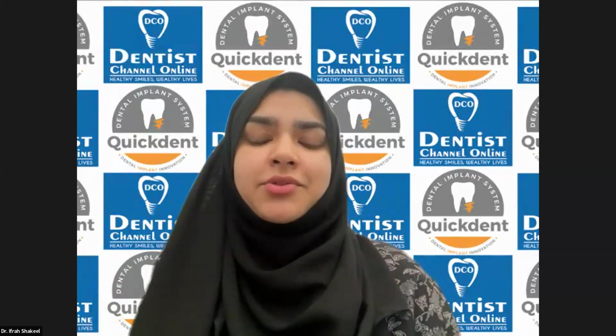All right. The next question is, which implant is universal for tooth replacement? I just told you that there is nothing like a universal key. The problem is that everyone wants to open all the locks with a single key. Corticobasal implantologists place basal implants all over, whether you have good bone or bad bone, single or segmental, everything. And conventional implantology places conventional implants all over. Actually, we have to see the patient, the situation, what the patient needs, and what the bone condition is, and accordingly decide.